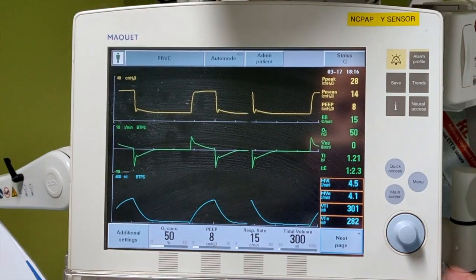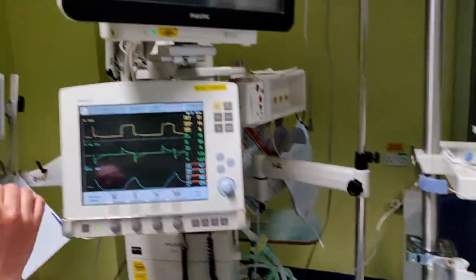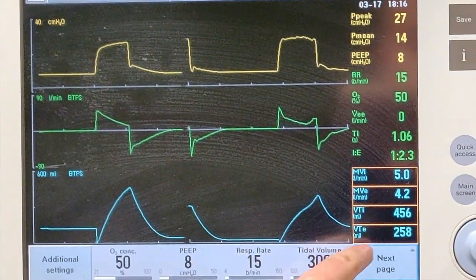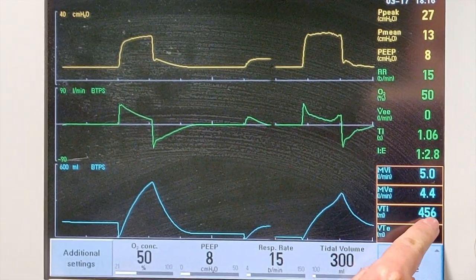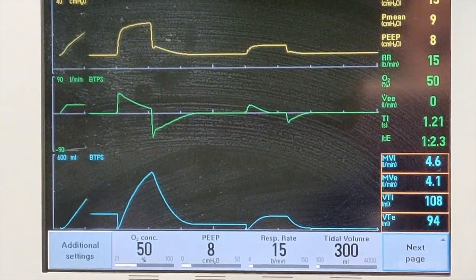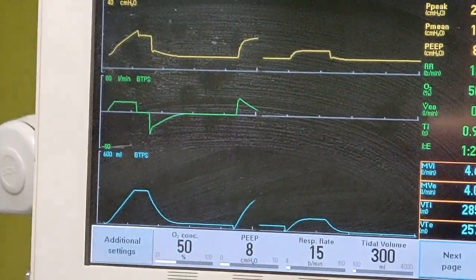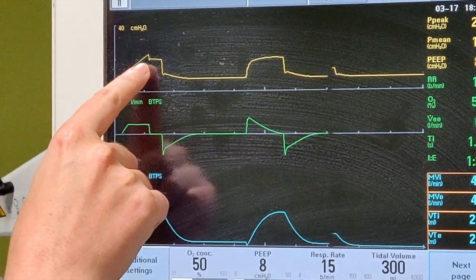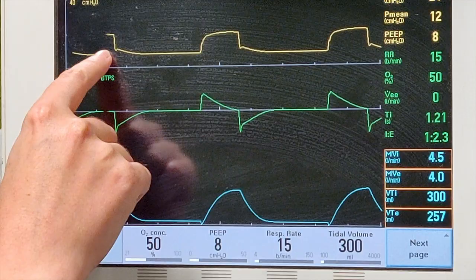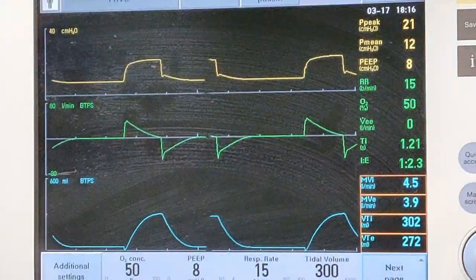Now the compliance improves. We open that up. The ventilator is still working at higher pressures. We get high volumes for a bit, 450, and then the ventilator tracks back again because it's such a big difference that we've just made. It throws a volume control breath, finds the alveolar pressure in the plateau pressure, and then targets that. And you see the big difference is now 20.